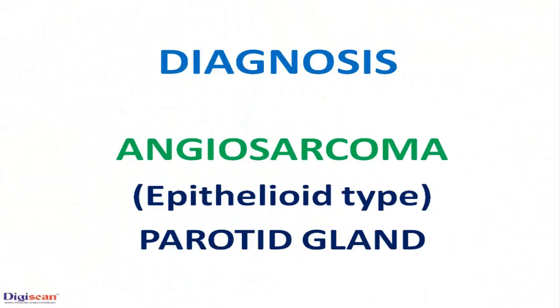Based on histomorphological features and findings of immunohistochemistry, a diagnosis of angiosarcoma of epithelioid type involving the parotid gland was made.